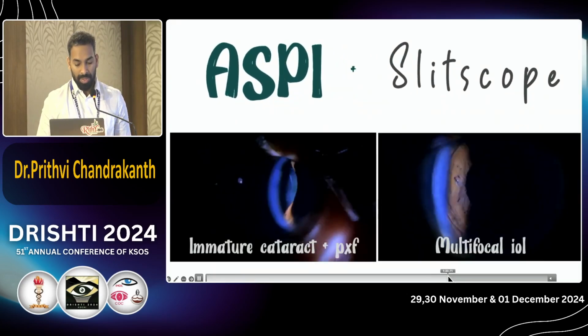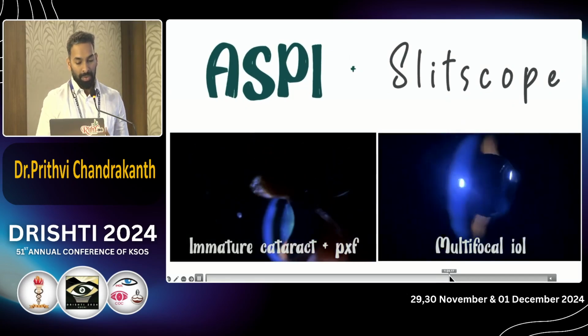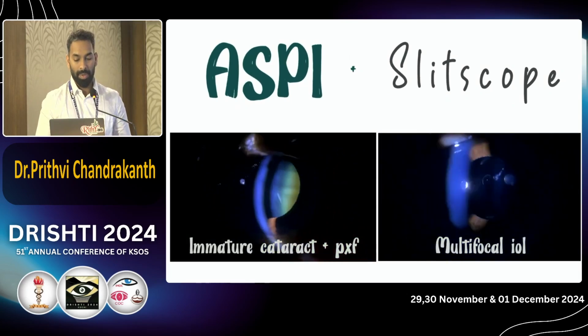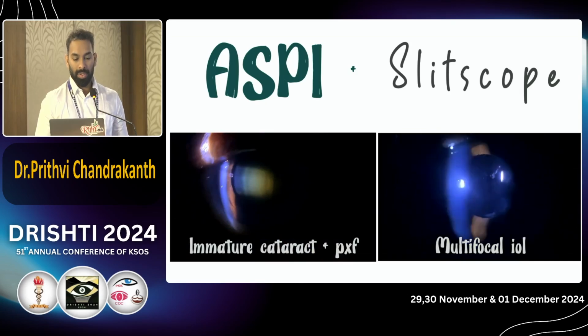Once we use that along with the ASPI, you can see these are all the images that we were able to take with the smartphone ASPI and the slit scope, and it was actually comparable to those with a slit lamp.